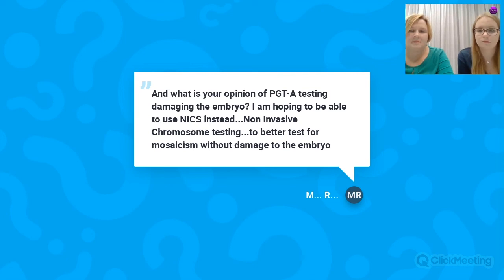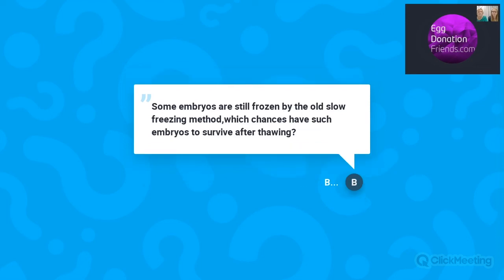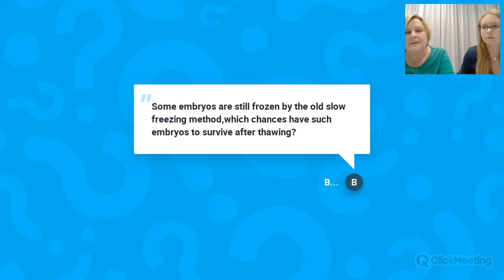Yes, and thank you for these answers to the question. We have the next question coming up. Some embryos are still frozen by the old slow freezing method. What chances do such embryos have to survive after thawing? Generally, the slow freezing method is used at the blastocyst stage, because at earlier stages it is different. But for blastocysts, survival after thawing is about 90%, and for cleavage embryos 85 to 90%.